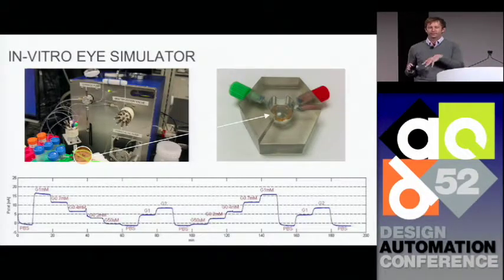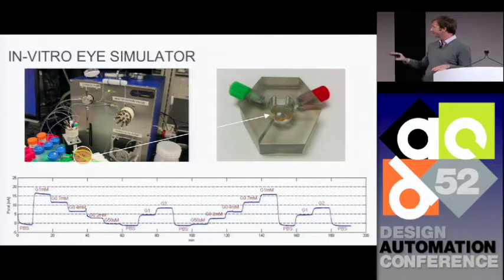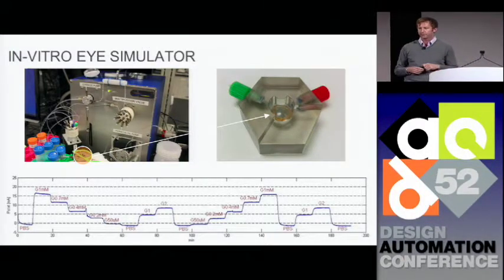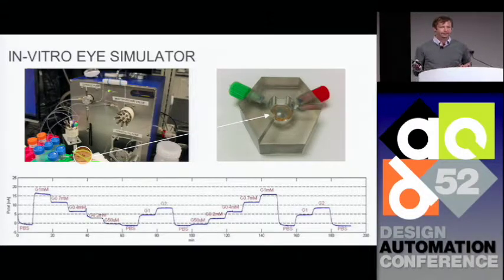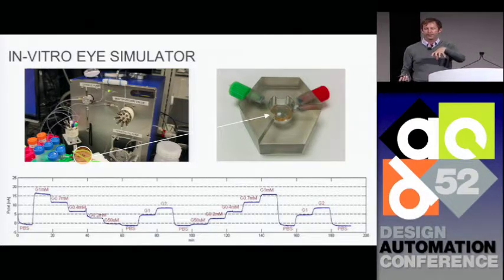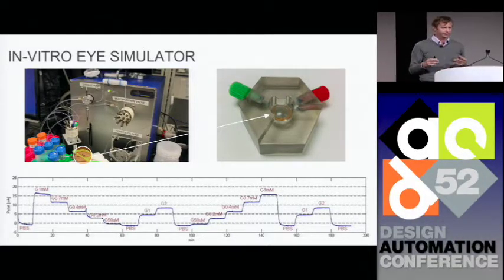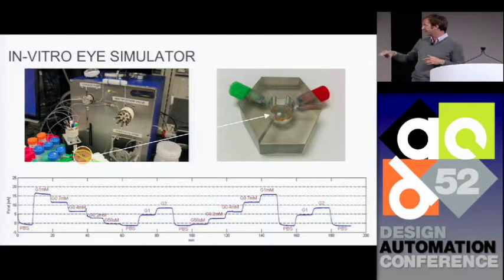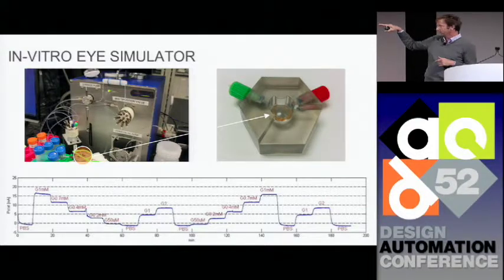So we have the device, we have the electronics, things look like they're working well. Then the next step is to actually test this on the bench. This is one of the tools that we use to characterize this technology. A lot of the stuff we had to do from scratch because there was no predicate for these types of measurements. On the top right is essentially an artificial eyeball. There's a little silicone pocket with curvature that matches the human eye. Put the contact lens on top of it, and we have a flow cell. That's the pump on the left. It's fully programmable, and it can flow different glucose concentrations inside of artificial tears across the contact lens. This is some representative data on the bottom showing glucose concentration.